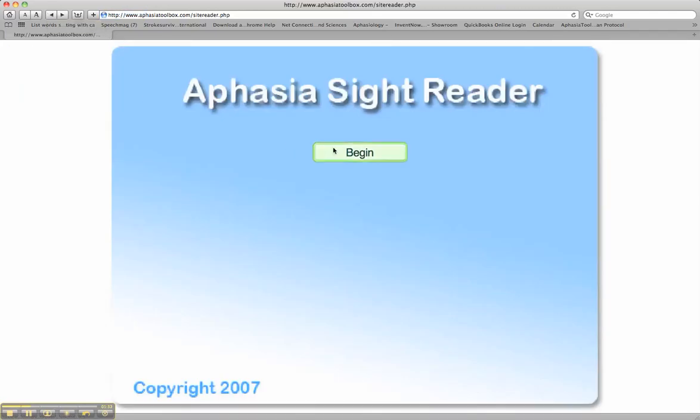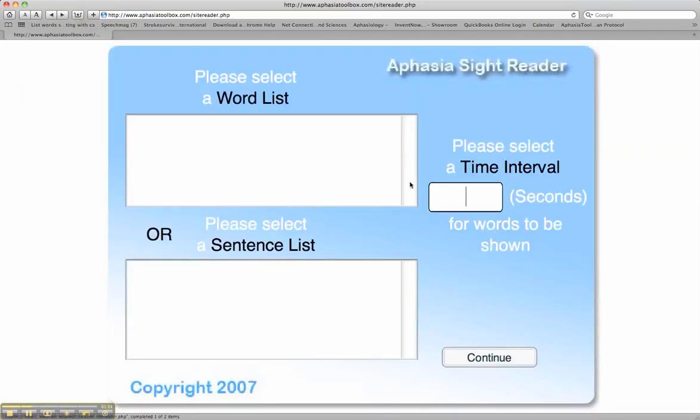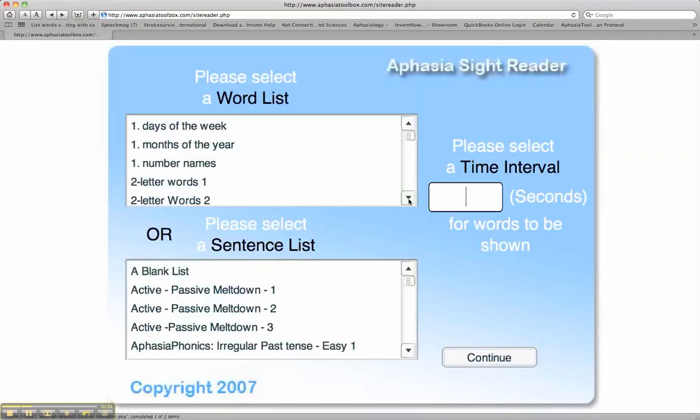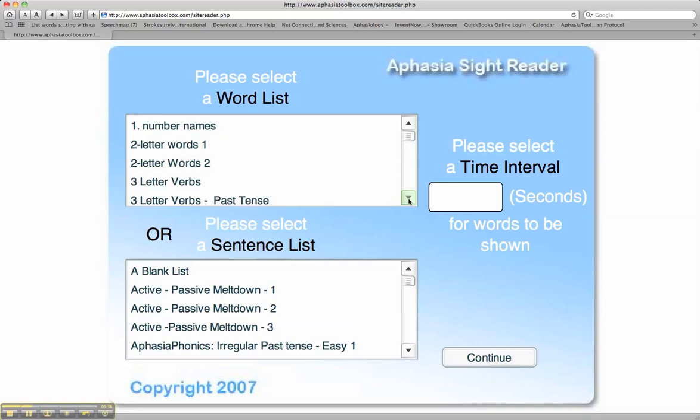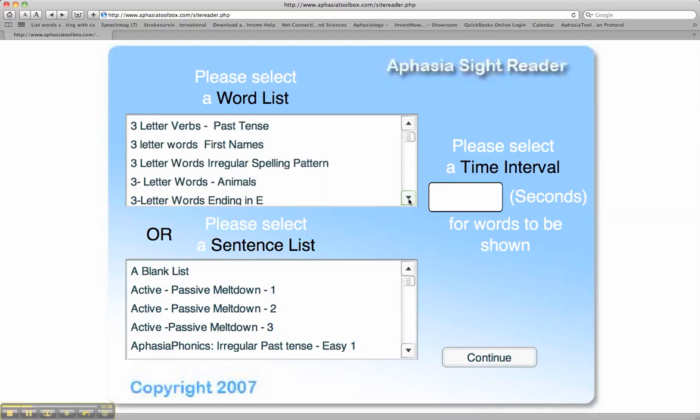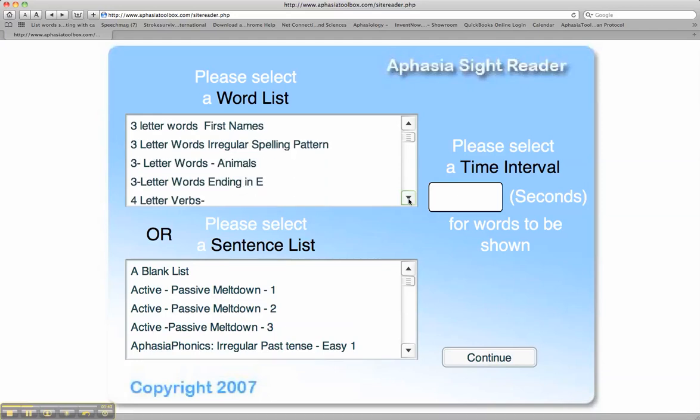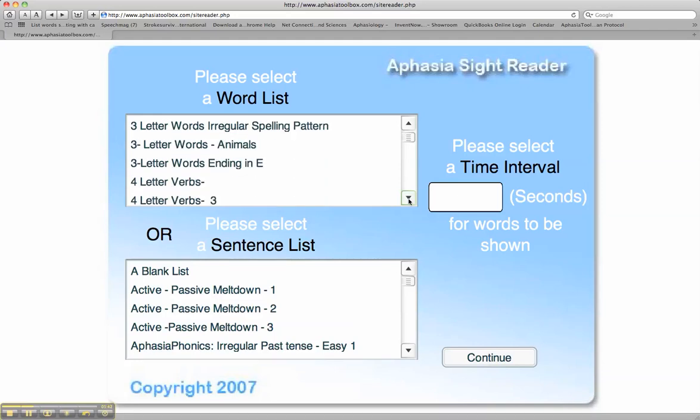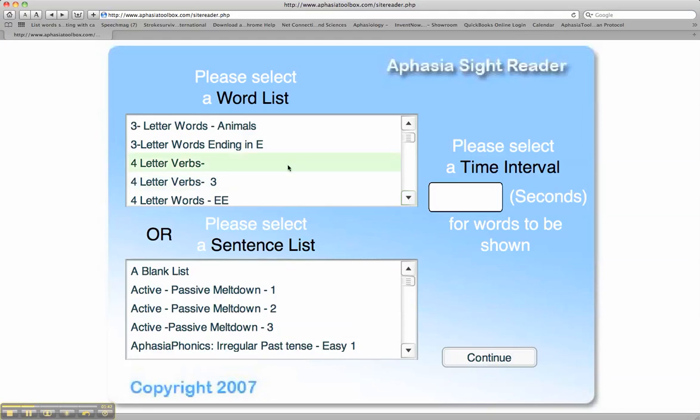You can then slowly, gradually make incremental changes, making the word stimulus longer. You can work on irregular spelling, or there's a step between two and three-letter words, which would be three-letter words all ending in E. We also have various categories to work within.